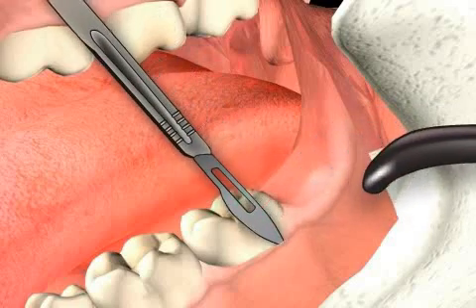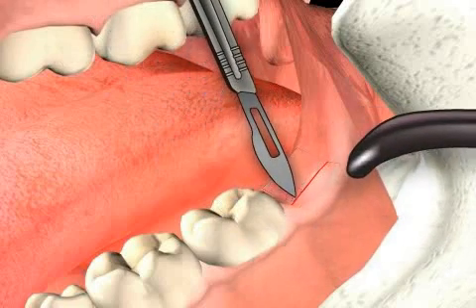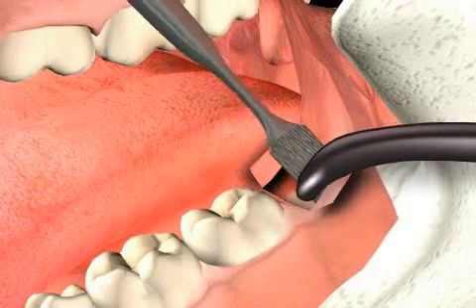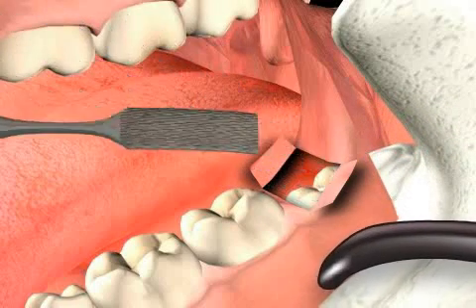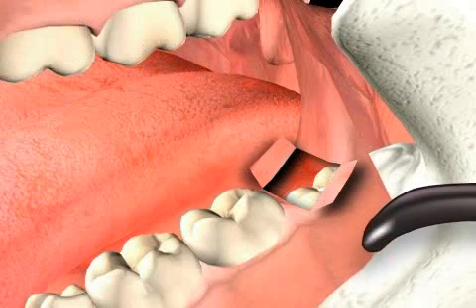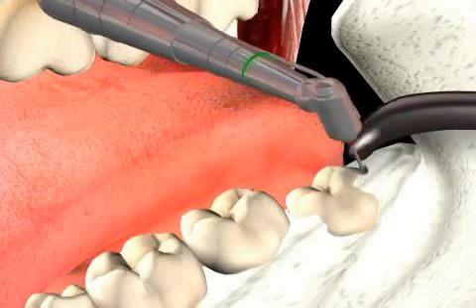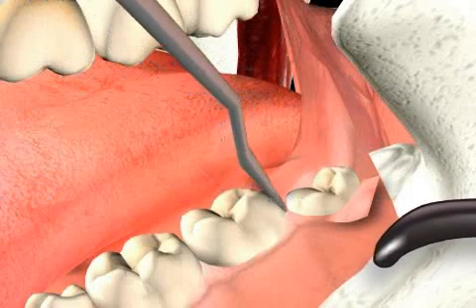When doing so, a so-called gingival margin cut is made along the ascending branch of the lower jaw and on the number 7 tooth. You can find out more in the video entitled Gingival Margin Cut. The gums are moved to the side with a raspatory, and thus the mucous membrane, including the periosteum, is lifted off the bone. A wide raspatory is placed underneath the periosteum in order to protect the other soft parts, such as, for example, the lingual nerve, because the bone is now removed with a drill. Although the sound of this procedure roars in your head, you don't experience any pain.